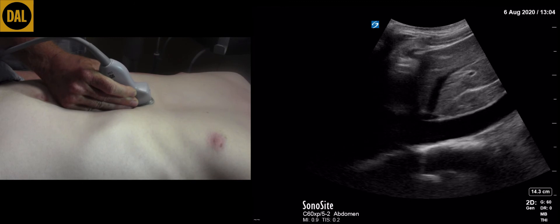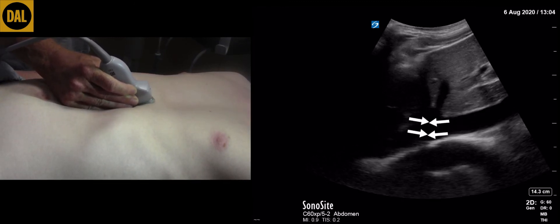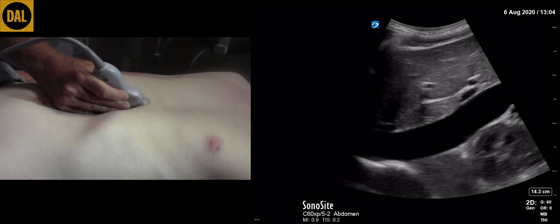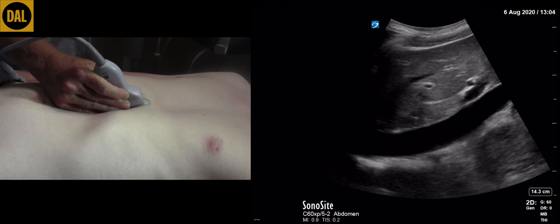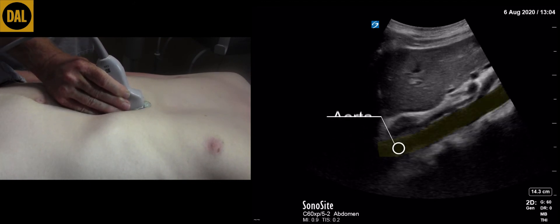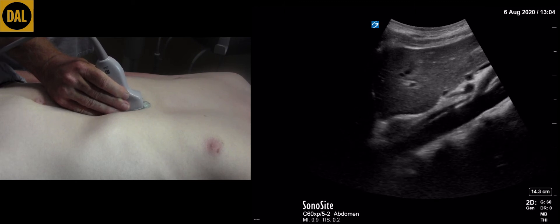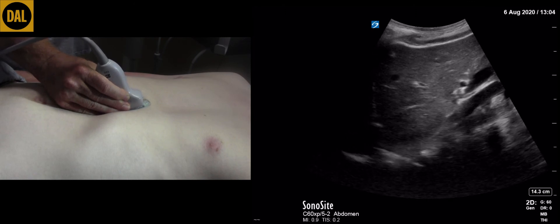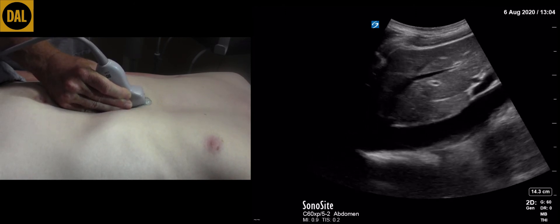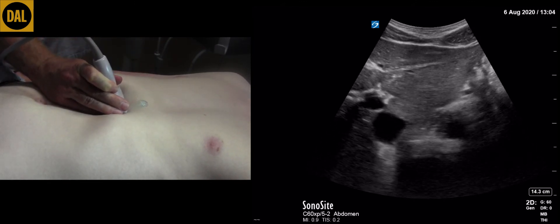Continue to tilt and rock the transducer until the junction of the IVC and right atrium is visualized. At some stage, quickly confirm that you are looking at the IVC by tilting the transducer to the patient's left until the aorta is visualized, then tilt the transducer back to the IVC. Finally, rotate the transducer anti-clockwise to visualize the IVC and the aorta in their transverse plane.